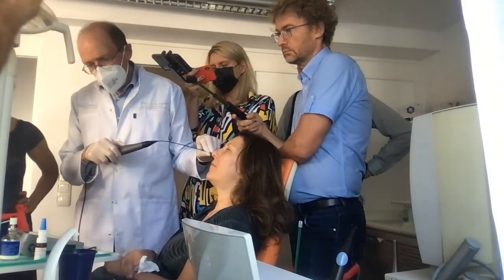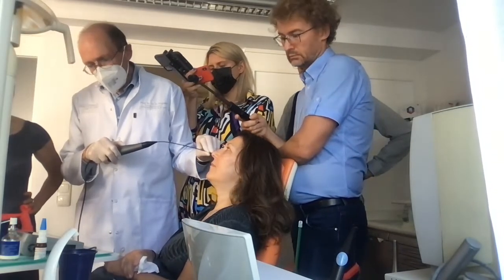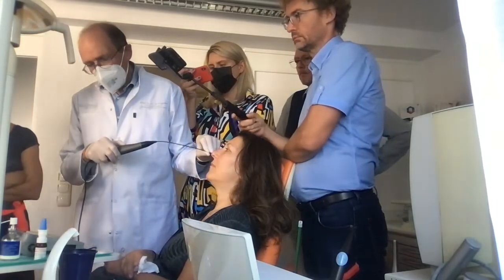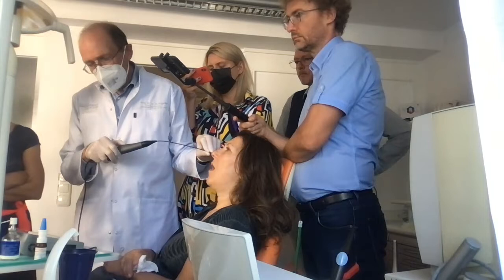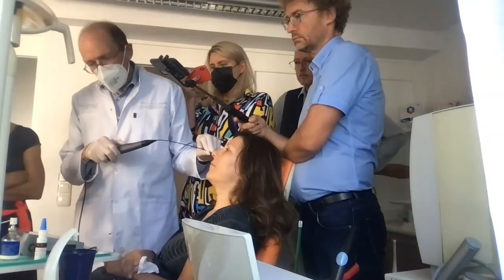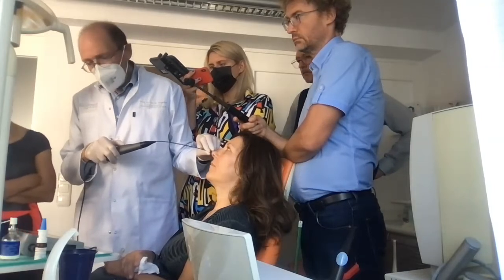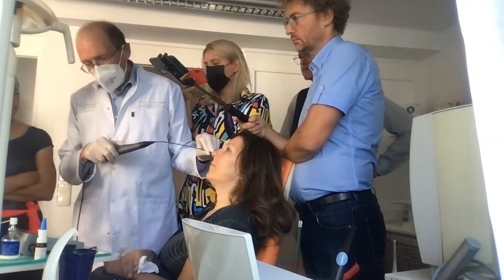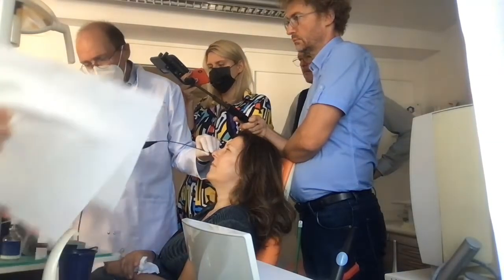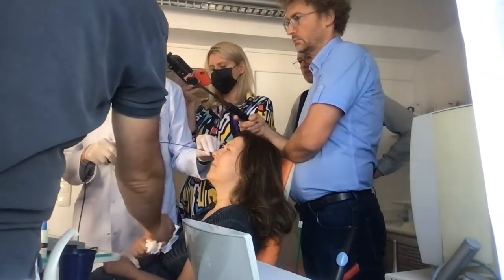So we can compare it now. This is the position when you're clapping the teeth. It's a narrow situation. What if she tries to snore with the mouth open? Is it different? Yes, maybe. Please open. Yeah, it's more closed. It's closing completely. And the closure is more controlled. So when comparing the device and the open situation, there is a difference, but it is not a 0-1 situation, but a gradual one.